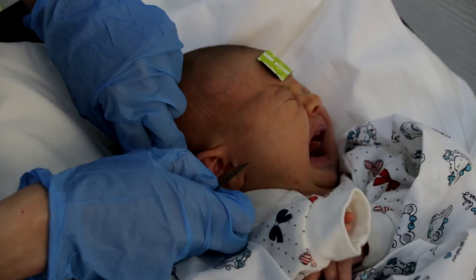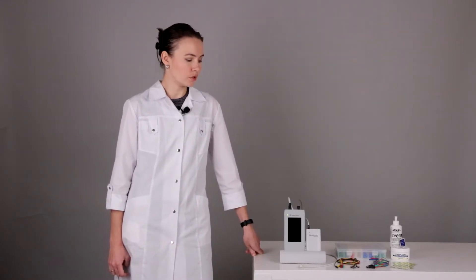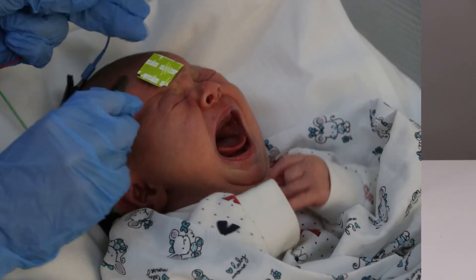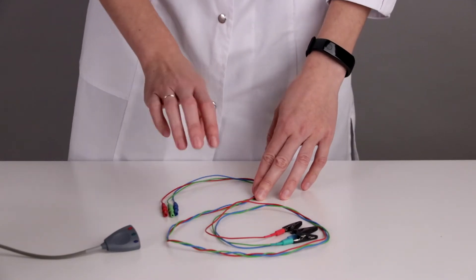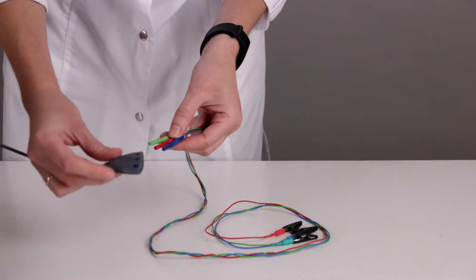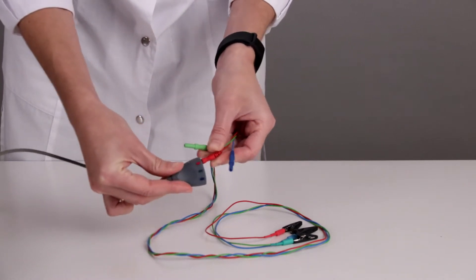We can use single-use hydrogel electrodes or also cup electrodes. Before positioning cup electrodes, we need to fill the cup with adhesive paste. After positioning our electrodes, we connect them with alligator connector cables. The cables must be twisted around to minimize the influence of electromagnetic noise, and then we connect our electrodes with the cables to the special electrode adapter, which has color indication.